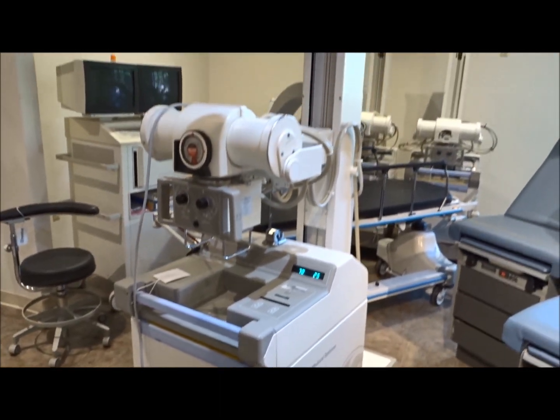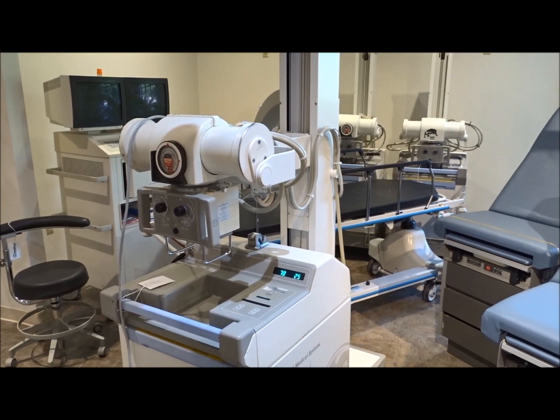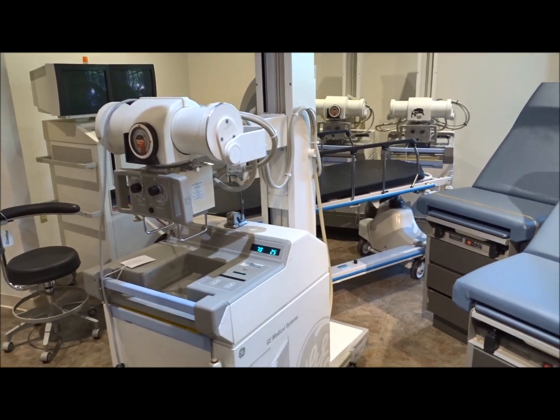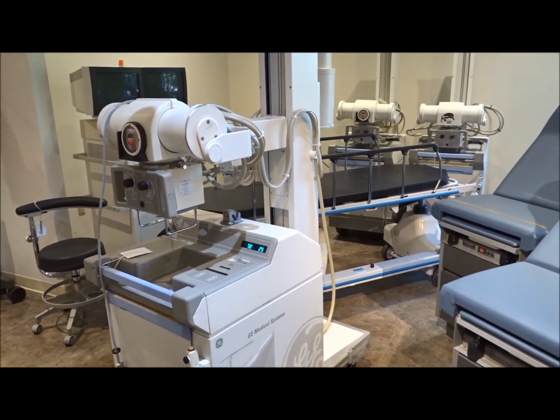Available now through iMedical in the Virginia area and also in Southern California. We can ship the AMX 4 Plus units anywhere in the United States and anywhere in the world.